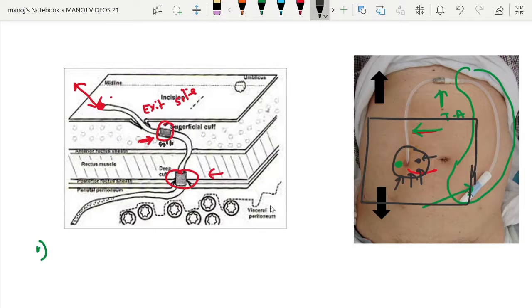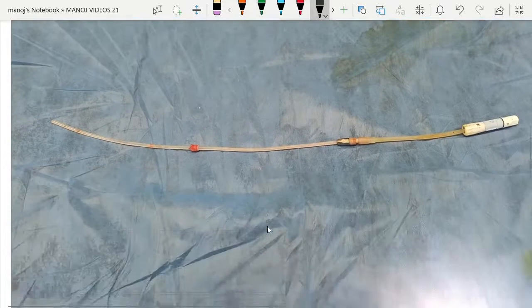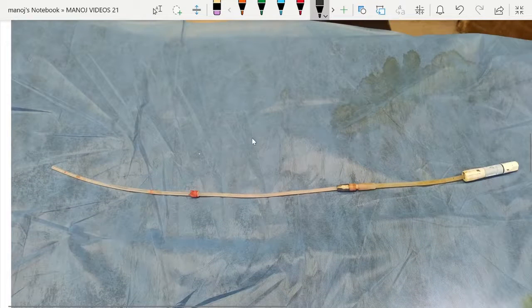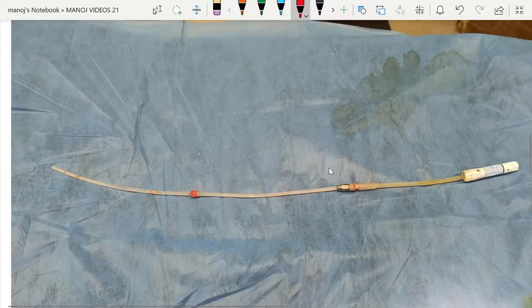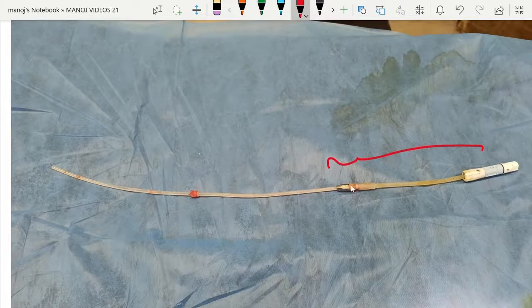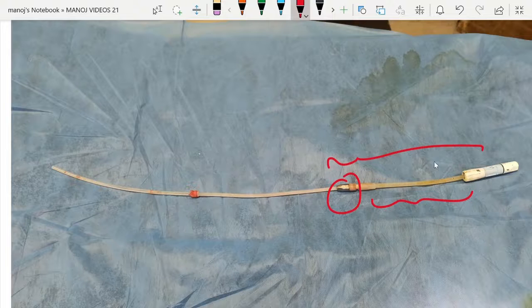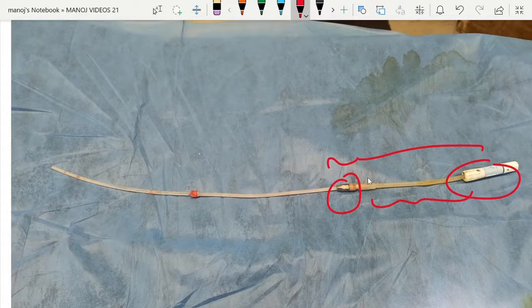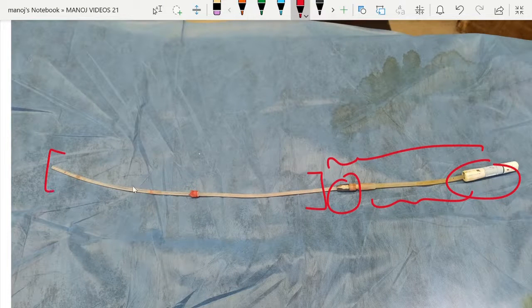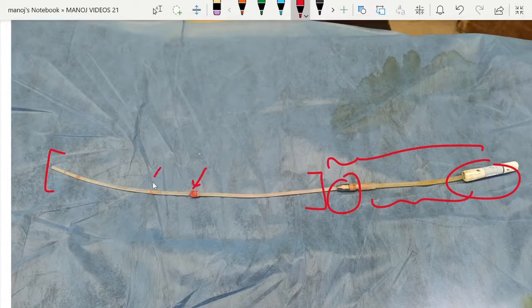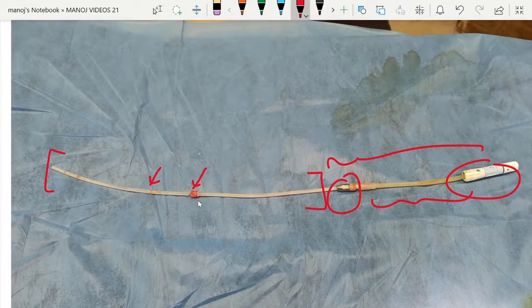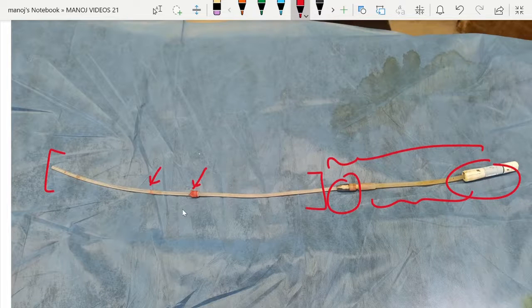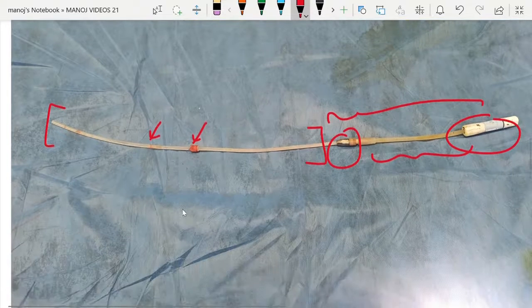This is the image of one catheter we removed today. This is the titanium adapter, transfer set, twisting clamp. This is the catheter. We are having this superficial cuff and the deep cuff. In this patient, the superficial cuff was somewhat within three to four centimeters from the exit site.